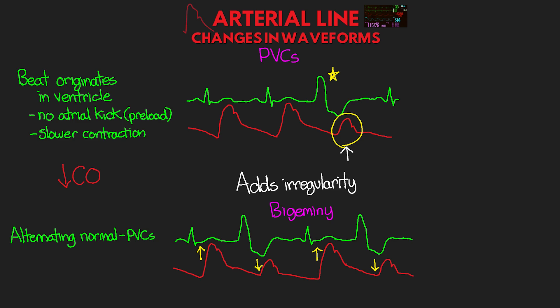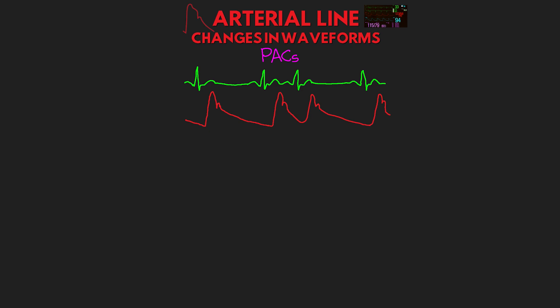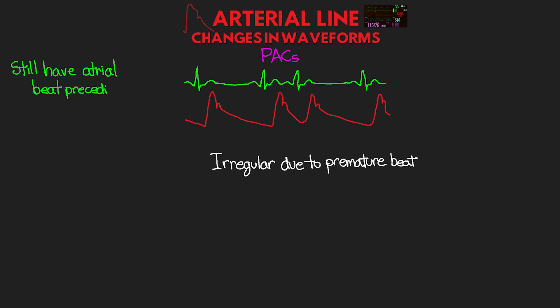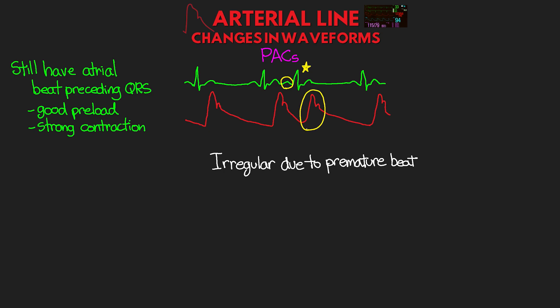The next abnormality is premature atrial contractions or PACs. With PACs, we'll also see irregularity due to this premature beat. Unlike PVCs though, we still have that atrial beat preceding the narrow QRS, meaning good preload and a quick strong contraction. We can see PACs originating from different parts of the atria, which can have some small impact on how well the atria contract, but for the most part this is not going to be noticeable in our pressure tracing. As you can see in the example here, we have the irregularity from the premature beat, yet we see no major difference in the arterial waveform.